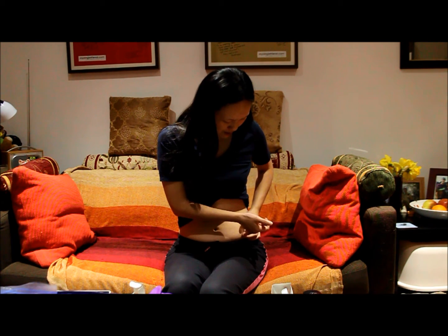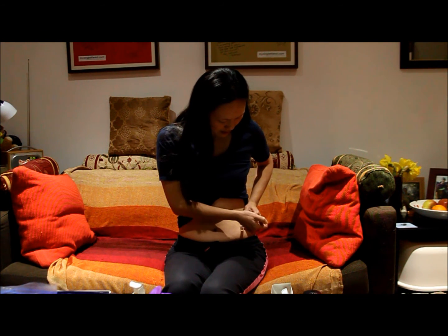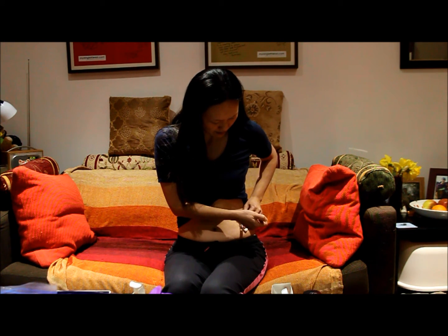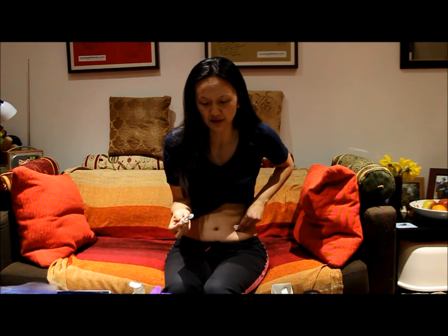That's a common fault my nurse mentioned — you pinch too hard, especially when nervous. When you're ready, start pushing the plunger down. I've heard other videos mention counting clicks, but with 300 units going down in 12.5 increments there are far too many to count, so just push all the way down. When the plunger goes all the way down, count to ten: one, two, three, four, five, six, seven, eight, nine, ten. Then when you're ready to pull out, push down gently with your cotton pad as you pull the needle out.